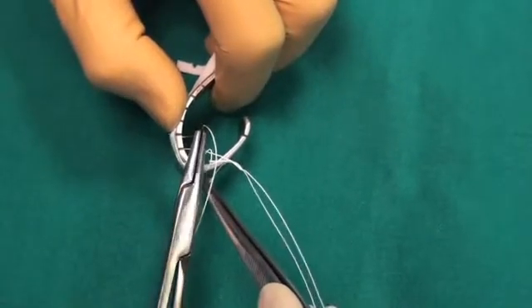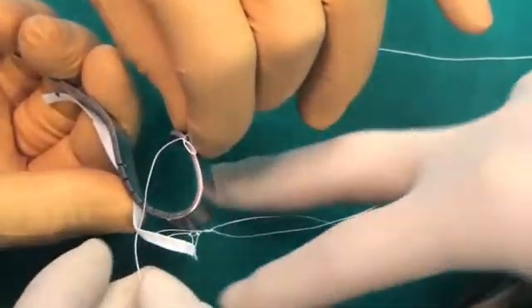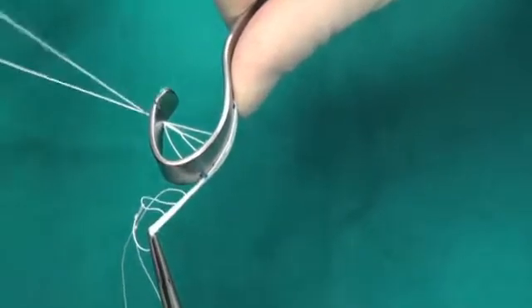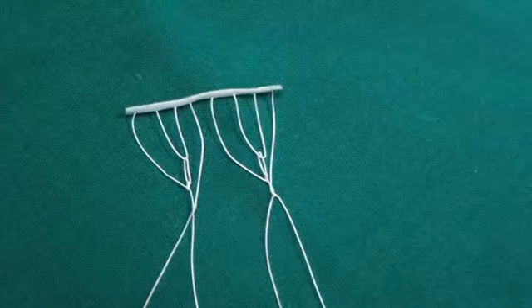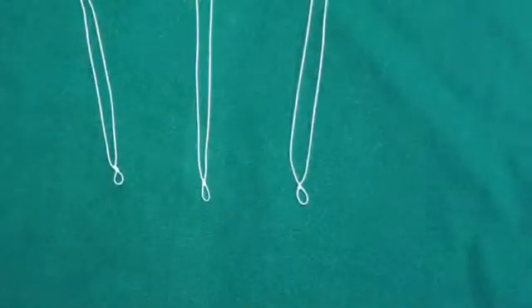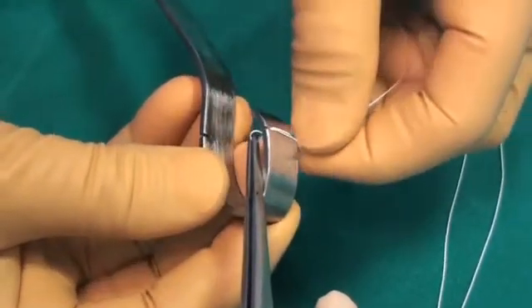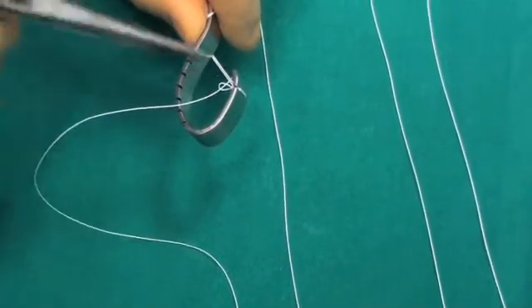The second set of corda is made the same way. The first step is the same as the single one. The main difference from the first model is that this one is entirely composed of Gore-Tex stitches. After attaching the first stitch, a second one without the needle goes through the loop and is placed over the edge of the Faraboeuf.